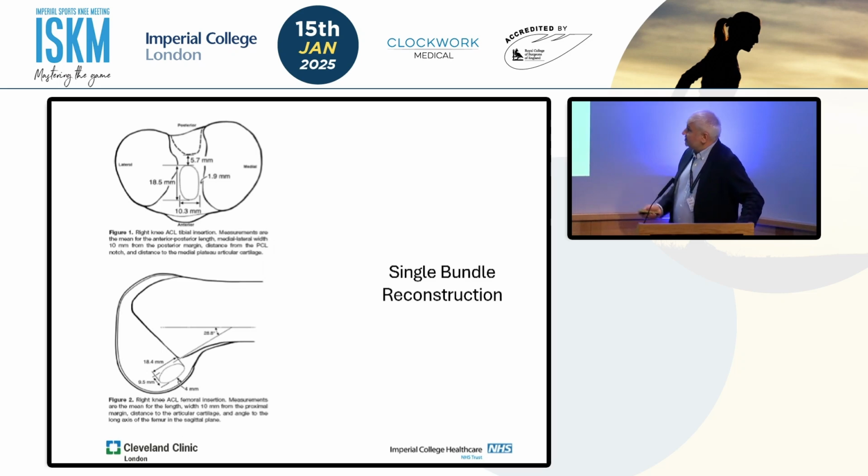These are the choices that we have. So if you look at this, again, the previous slides have told us that there's a large variability on the tibial tunnel. And one of the tips I picked up from Leo all those years ago, 20 years ago plus, was that he experimented a lot in going front to back on the tibial side, but on the femoral side, it was very, very consistent. You want to stay posterior as possible.